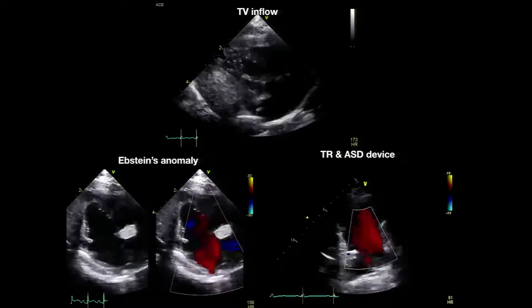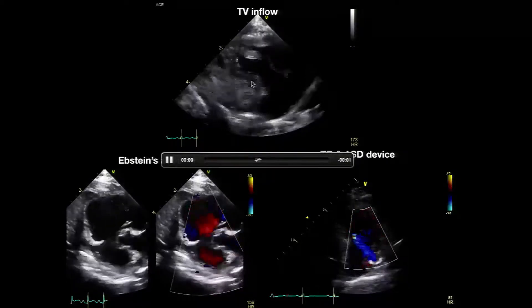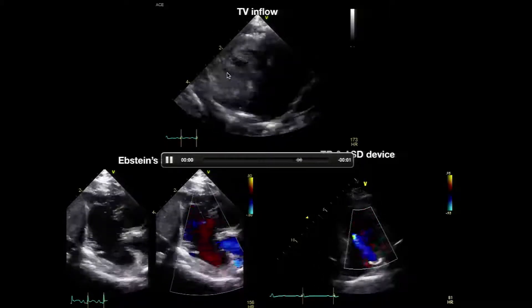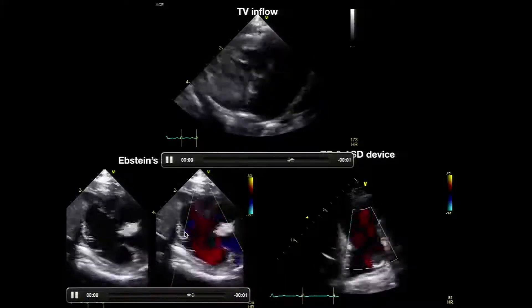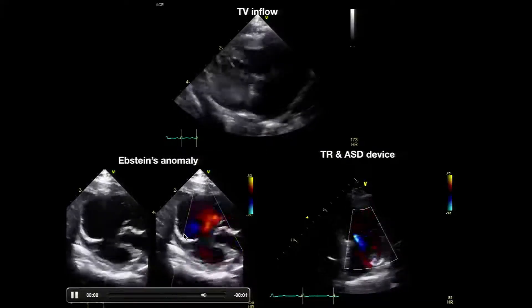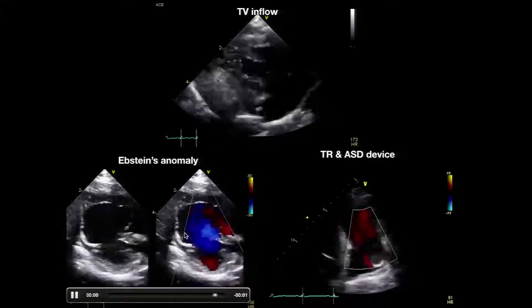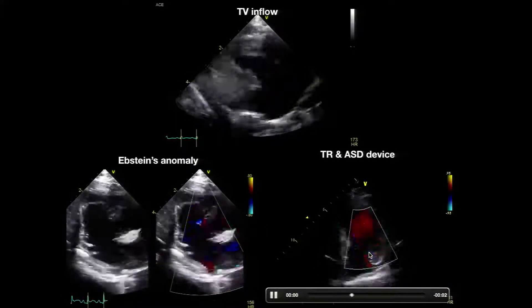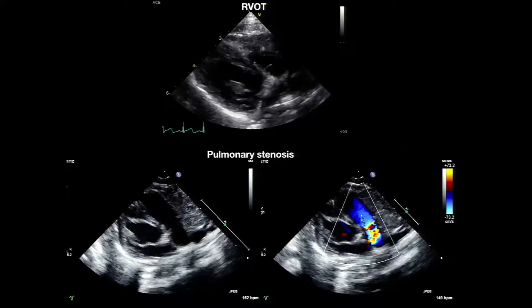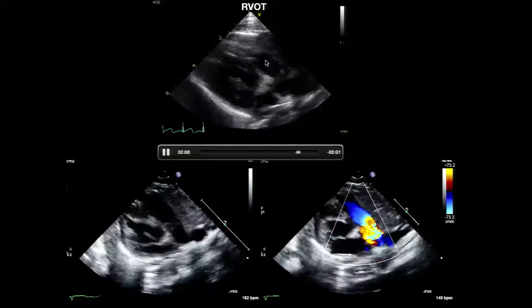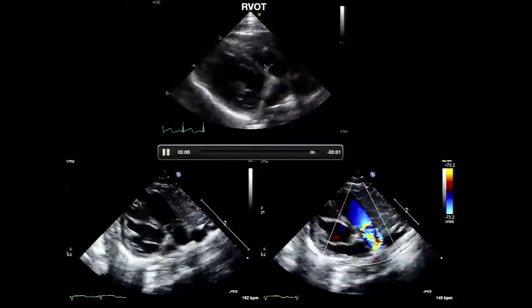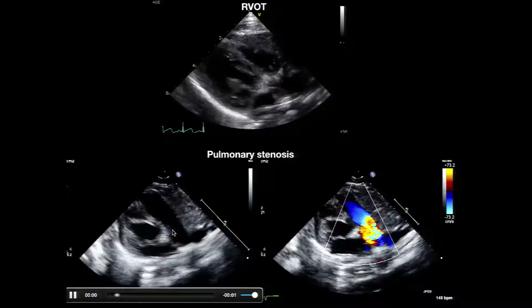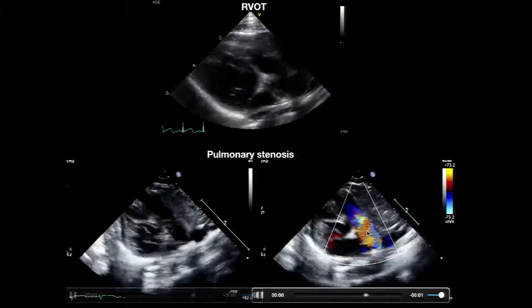The tricuspid inflow view allows evaluation of the tricuspid valve and RV function. This is an Ebstein's anomaly patient with apical displacement of the posterior leaflet, along with a TR jet in an ASD device patient. The RV outflow tract view allows measurement of the pulmonary valve annulus. In a pulmonary stenosis patient, you can see doming of the valve and color aliasing at the valve level.